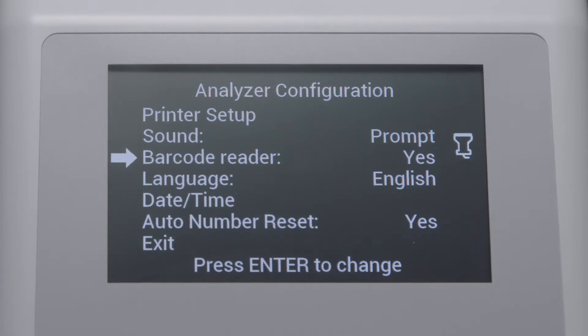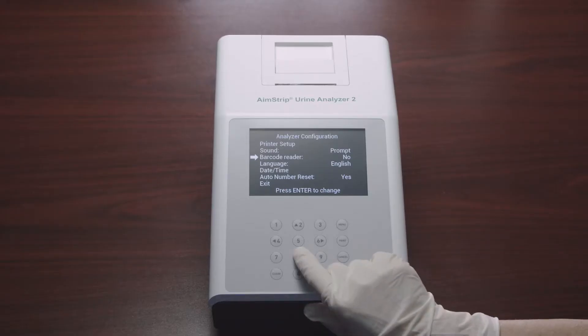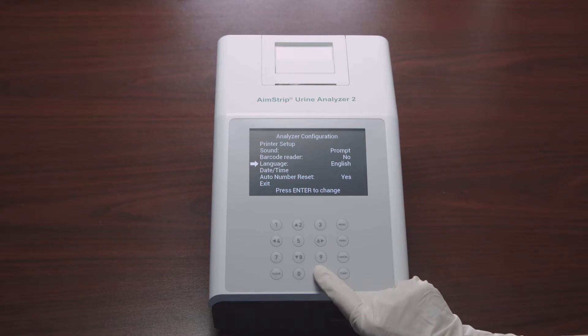Press Enter to cycle between Yes or No. Yes enables full usage of the barcode reader and the barcode reader icon will be shown. The barcode reader must be set to Yes in order to manually enter patient ID numbers — at the time of the test, the analyzer will prompt you to enter the patient ID using the numeral keys. If the optional barcode reader is not present and you do not use patient ID numbers, this setting can be set to No.